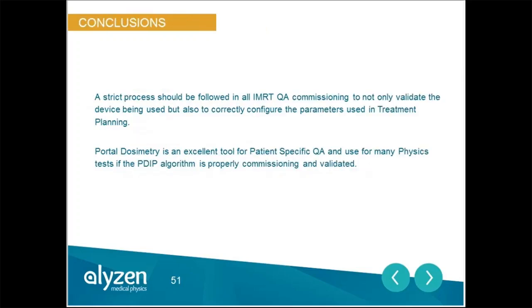So in conclusion of all of this, no matter what IMRT QA commissioning or IMRT commissioning you're doing, it's important to really follow your process: verify your output, verify your open fields, then move on to transmission, then DLG, and then you can actually start delivering test plans. Not only to validate your device, but also to validate all the parameters used in the MLC and your output, for example. But if done correctly, portal dosimetry is a great tool to do patient-specific QA. It's great to use for physics, and as a device for the clinic, it's excellent.